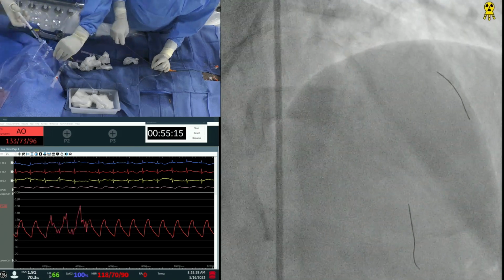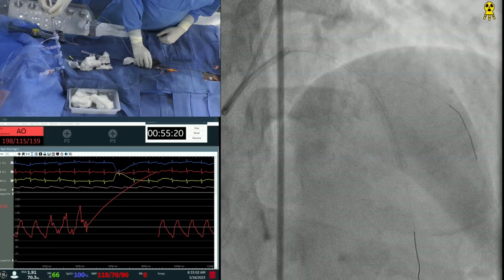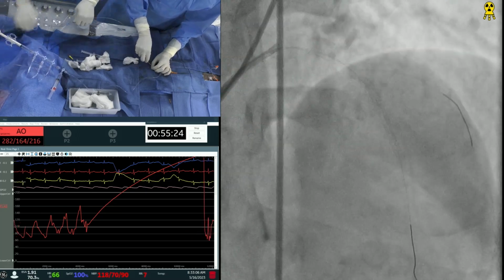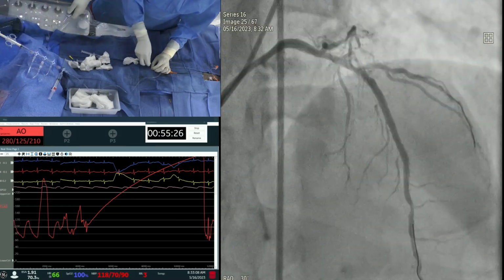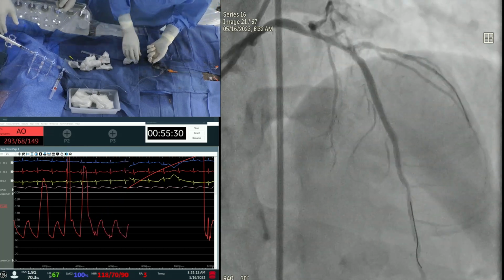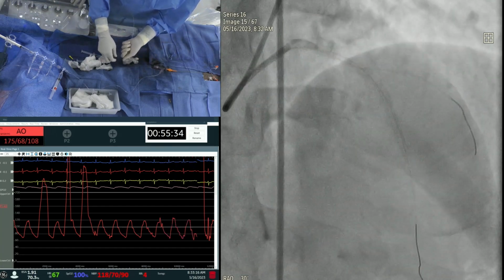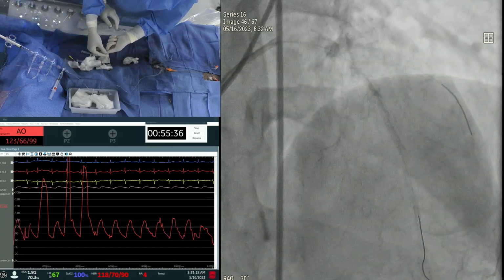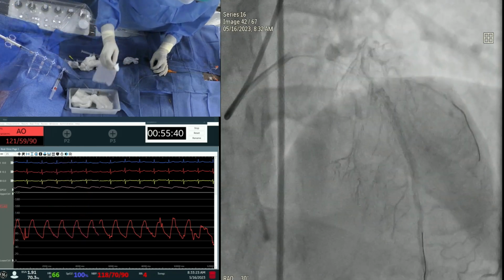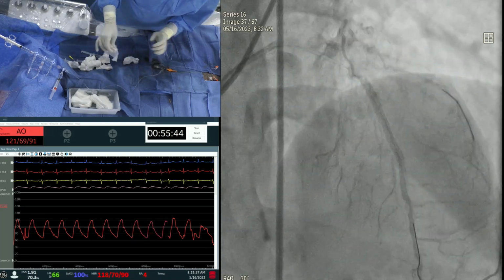Take a picture. Another person who's been observing a lot says, is mini crush your preferred bifurcation technique? Actually, Vishal is looking at 1800 bifurcation cases, all the angiograms over the last few months, and based on what technique, what will be the outcome, what is the MLD of the side branch with mini crush, with DK crush.